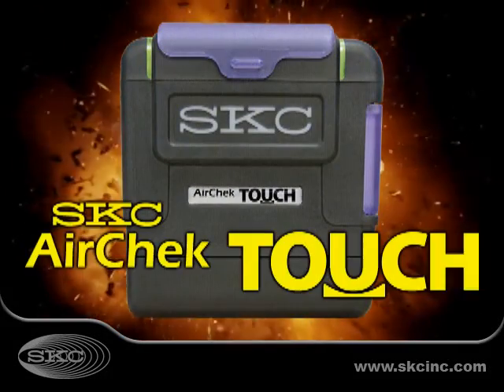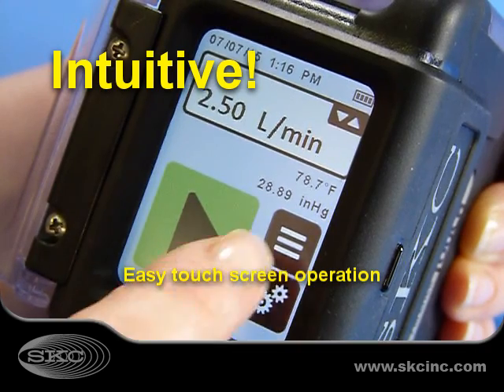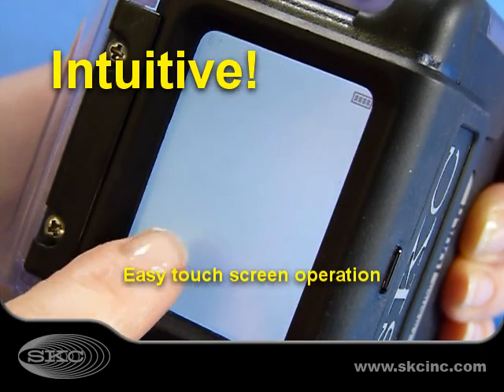Introducing the SKC AirCheck Touch Sample Pump, the ultimate in sample pump innovation. With its highly intuitive color touchscreen, you don't even need an operation manual.